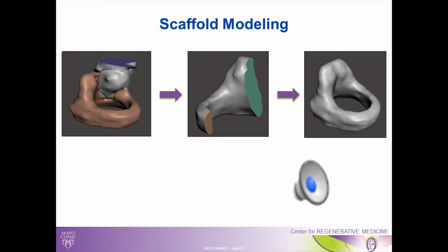We can then take that, here's just another view of the tumor in place, and take the normal looking tissue, say, okay, well, we know we want the other good half of that cartilage to look like this, so we can get that, model that, and then take the mirror image of that and print that off, and you can then see, okay, this is what it looked like when we had the implantation in. So basically, it looks like a normal cricoid cartilage without the big tumor there. So how do you get those reconstructed? Again, I'll show you another example of this coming up quickly.